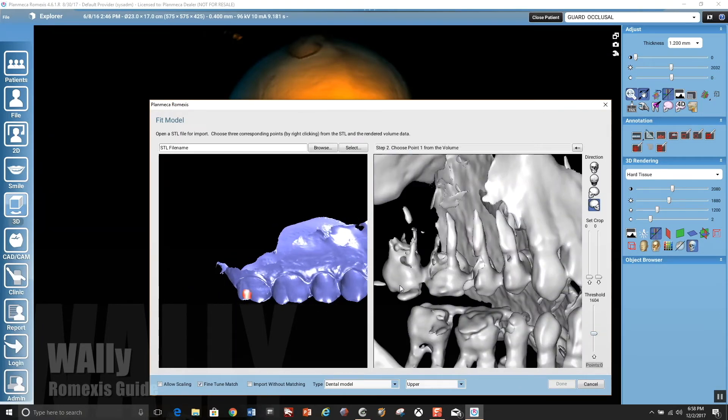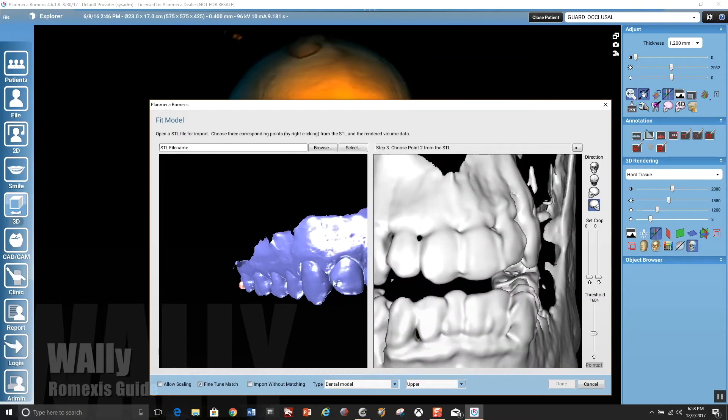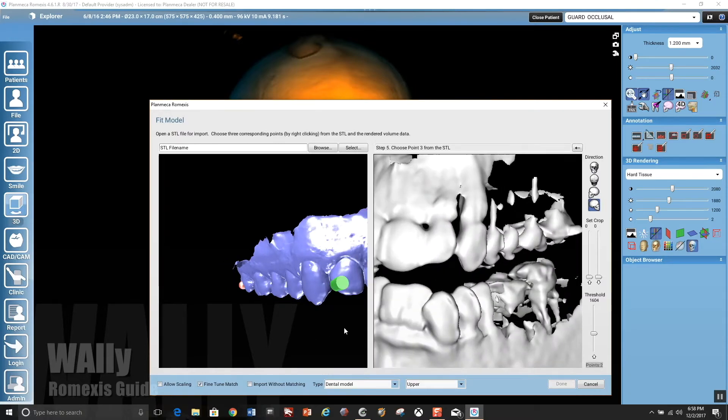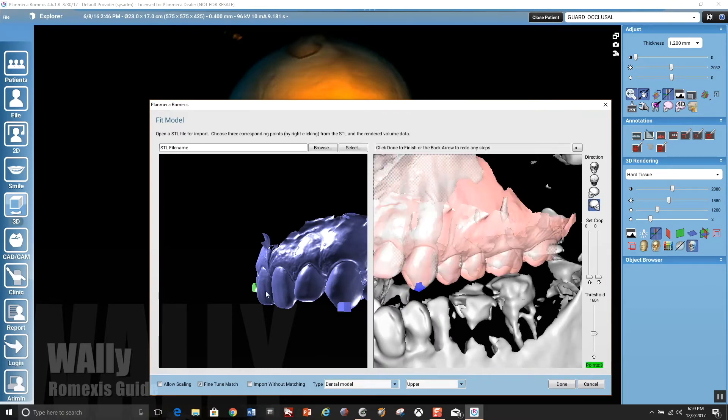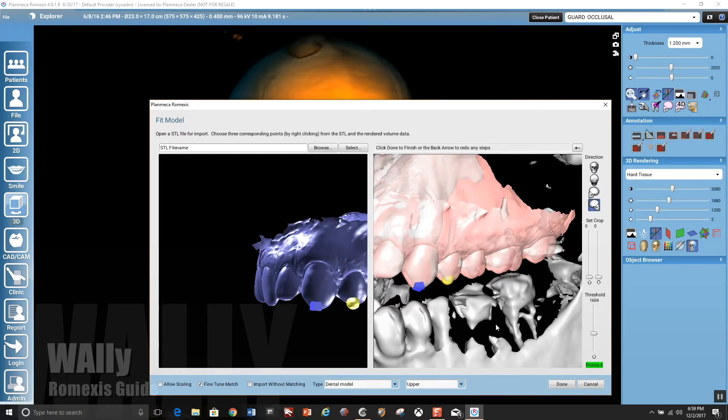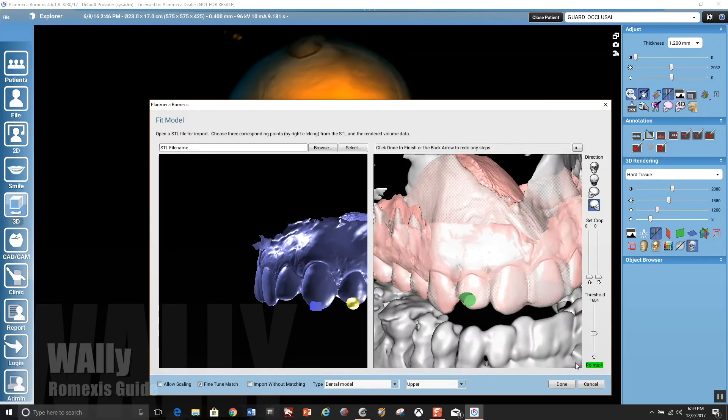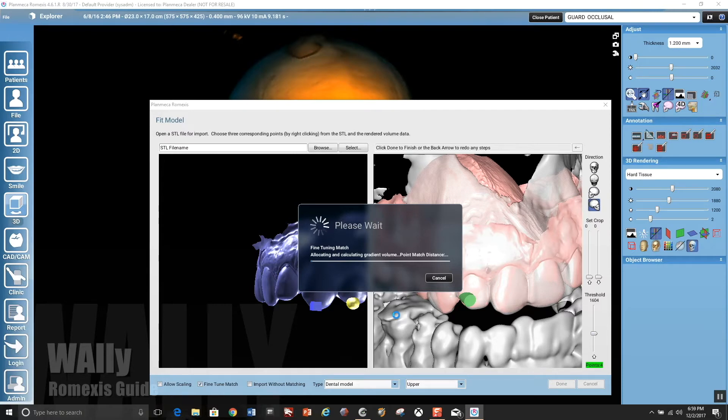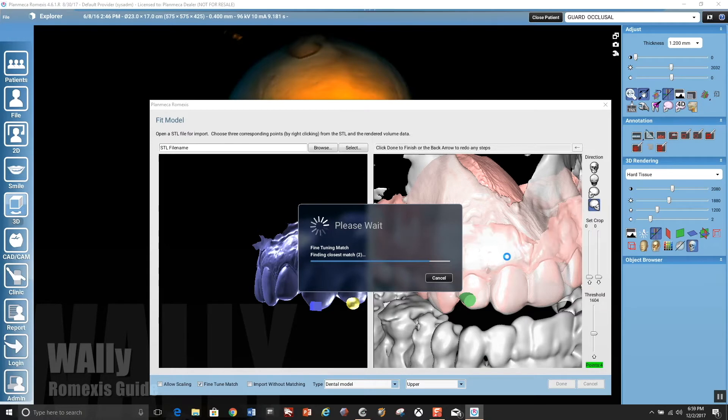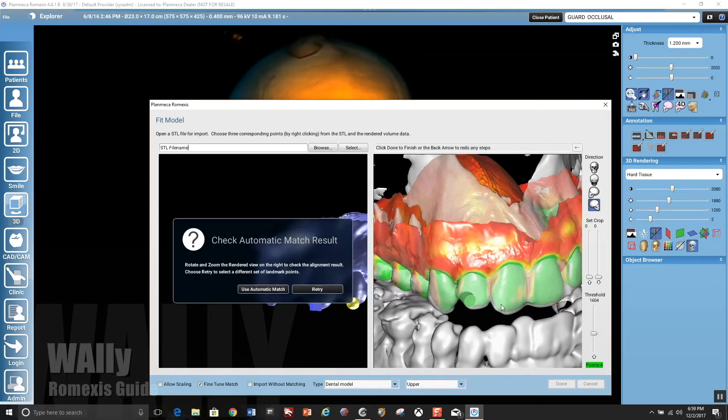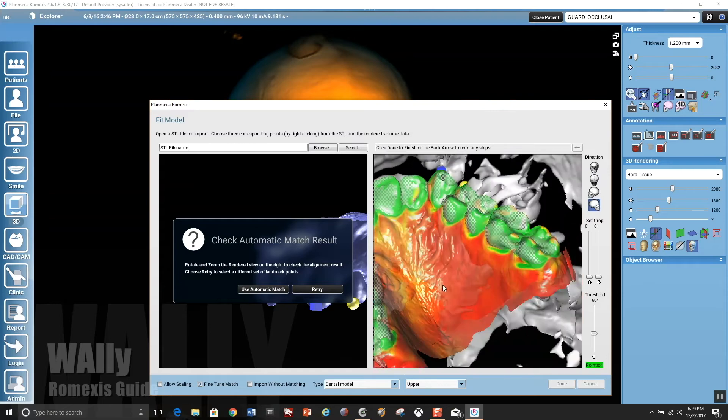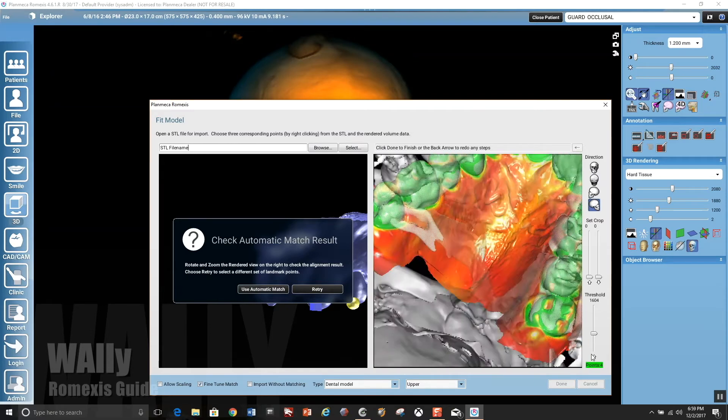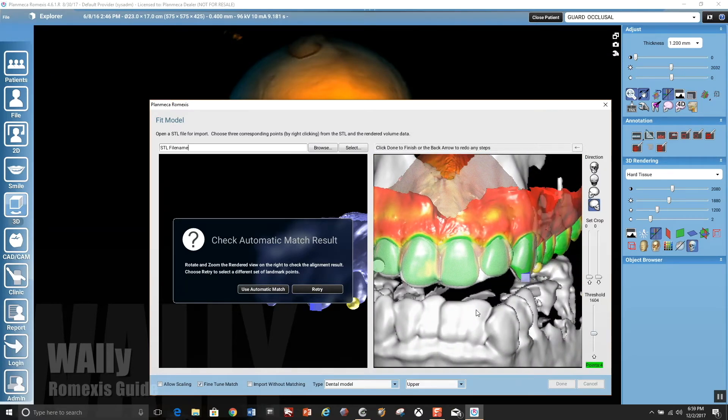But in this instance, we're going to go ahead and pick points. And the accuracy here is really not that important because we're not using the underlying DICOM data for anything, really, because we're not placing implants or anything like that. So we're just picking some points, and it's going to import that and merge that with that data set. What it will do after three points, you'll see the overlay, and then you could pick additional points, and then it will color code it where green is a really good match.